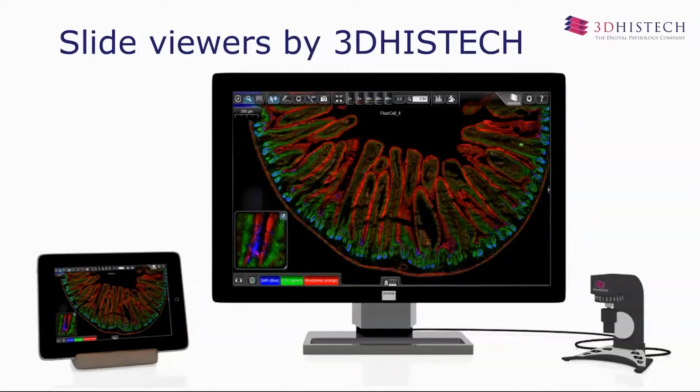Hello and welcome, everybody. First of all, I would like to thank Marcel for the nice introduction. During today's webinar, in the first part, I will give you a short presentation about our viewer solutions, and in the second part of the webinar, I intend to make a live demo of our CaseViewer software.